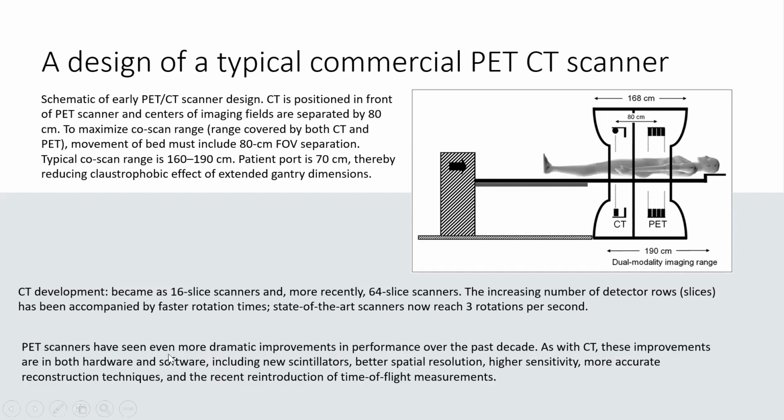Even the PET scanner has had a dramatic improvement in performance over the past decade, as with the CT, in hardware, software, new scintillators as we highlighted, better spatial resolution, and higher sensitivity. I just need to tell you that the patient port is 70 centimeters, to reduce the claustrophobic effect of extended gantry dimensions, because some patients will refuse to go into such a scan.